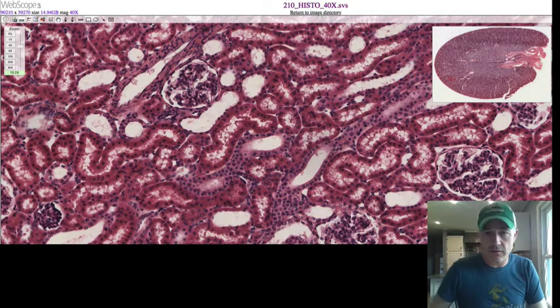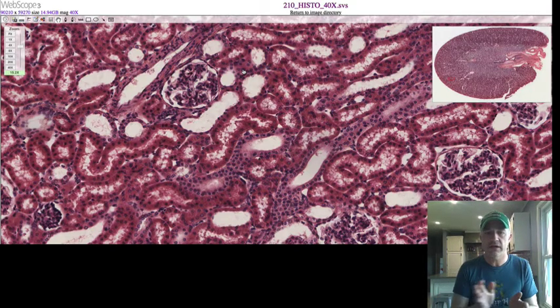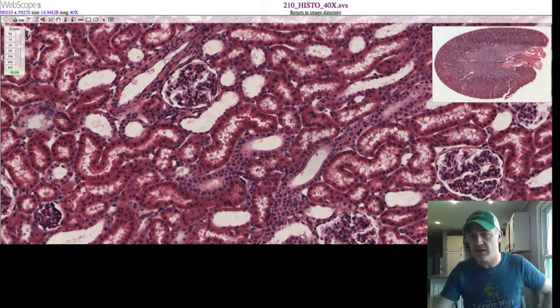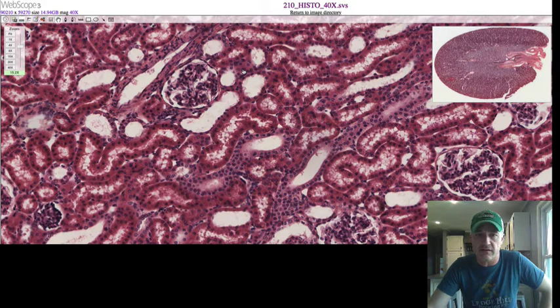So what we'll do is look at these on the side here, and the last show of this one is really just going to be taking a look at the other parts, which would be the ureters, the bladder, and the urethra. What I'm going to do here is look at about 4 different digital slides real quick to show you each of the different things. I've already zoomed them in on the areas. Usually I'd like to show you where I'm zooming into, but because each of these is a distinct area, I want to make sure I can find things and not waste a minute looking around and killing time with you guys.